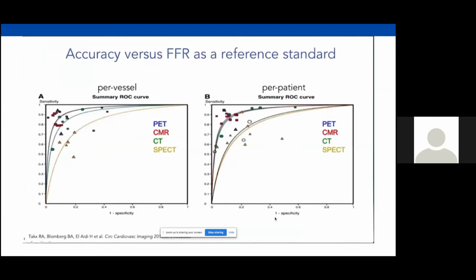So we know that there are a few tests available in this investigation modality. How can we tell, or are there good reasons to choose cardiac MR over the other investigations? Firstly, we should remember that PET, CT, and SPECT would involve ionizing radiation and radioactive isotope.